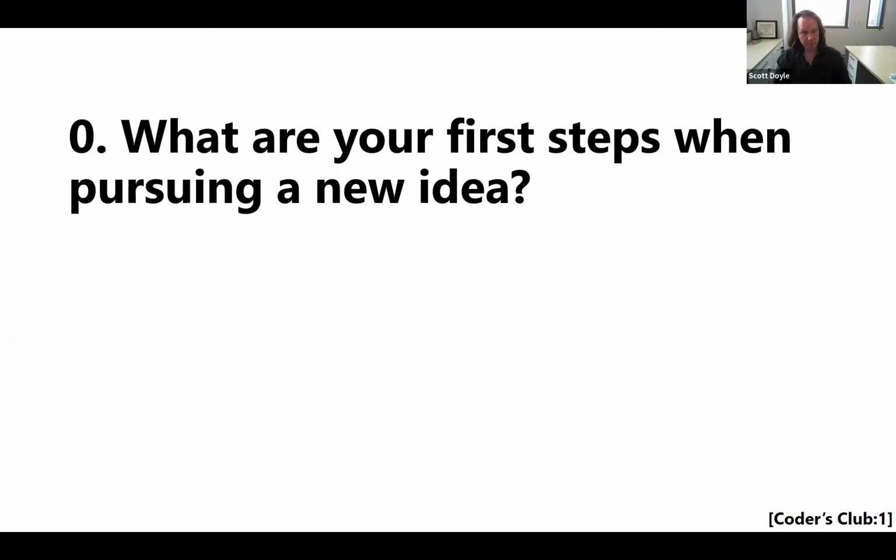Do we have the data to do it, et cetera? I think that's a great point, because when we end up reviewing a lot of papers, even if the experiments are scientifically valid and they're very robust and the classifiers are robust, I wonder how many of them would never be translated into a clinical setting and are more just academic exercises, because maybe the clinicians themselves have a very inexpensive blood test that they'll do instead, that they'll be able to, for example, get the same exact quality of information at 100% accuracy for $1, instead of having to set up a deep learning digital pathology infrastructure to get a 95% accuracy for the same type of thing. So I think having that scope is extremely important as well.